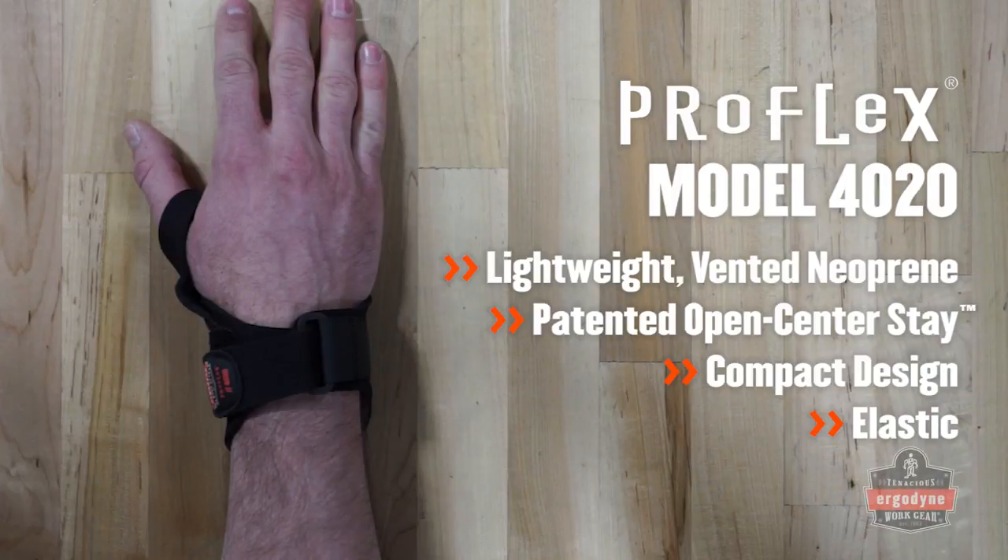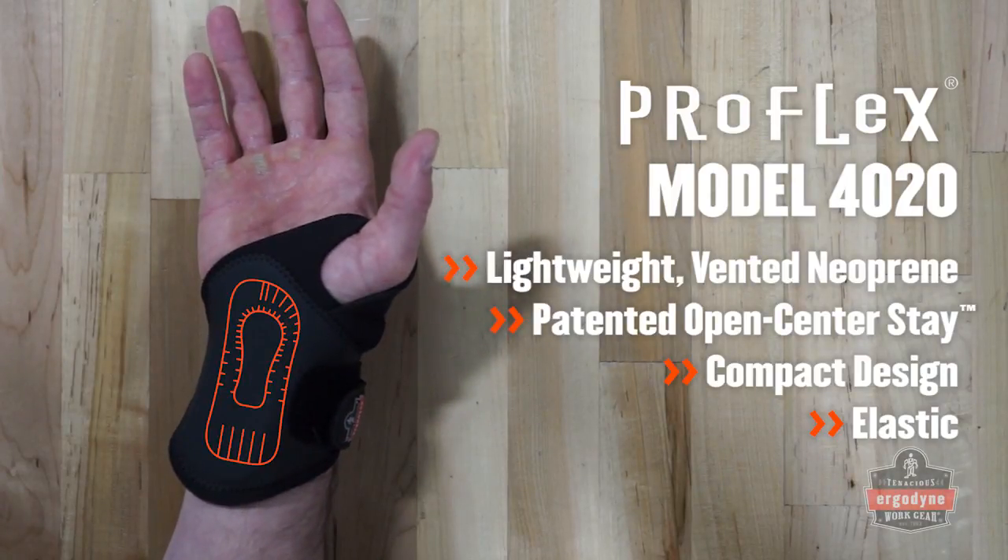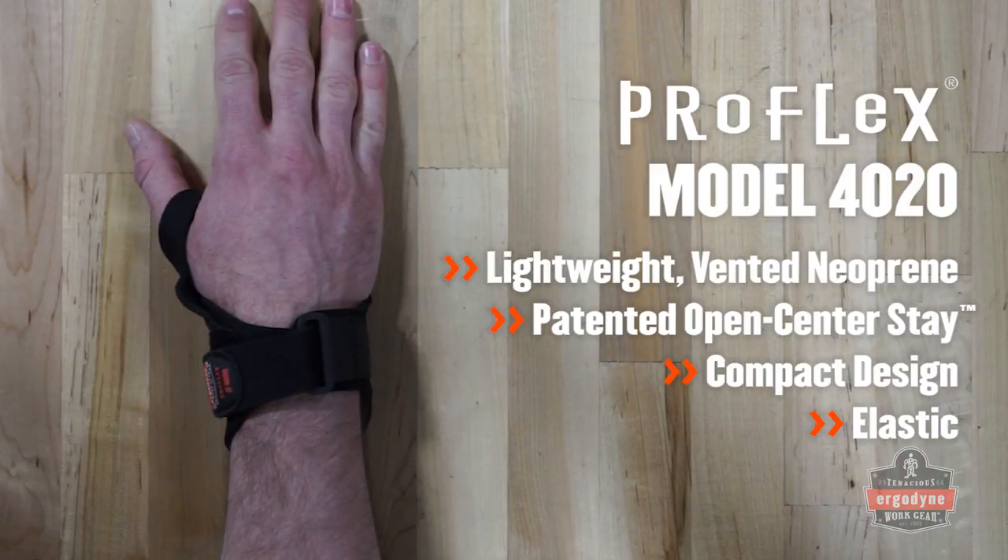The 4020 wrist support also features the open center stay, but in a lightweight, low-profile option that is ideal for office, retail, and light industrial applications.